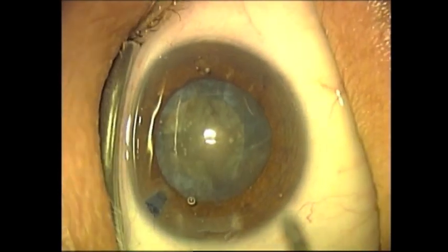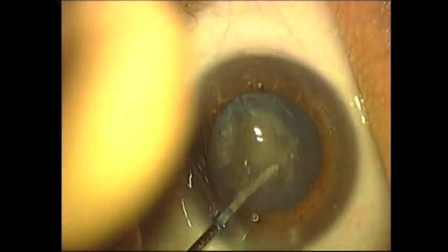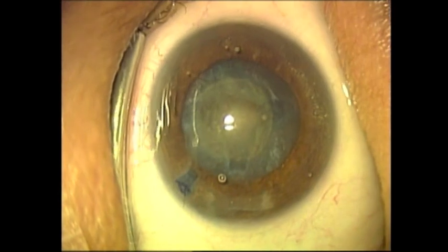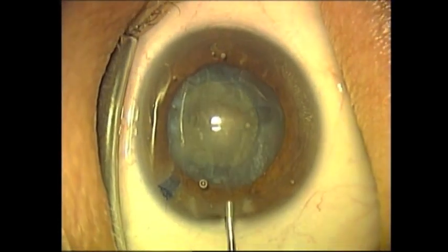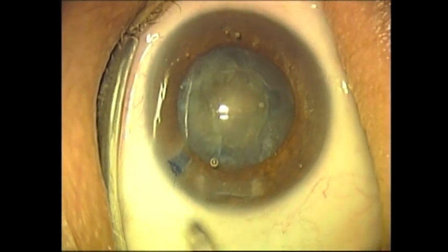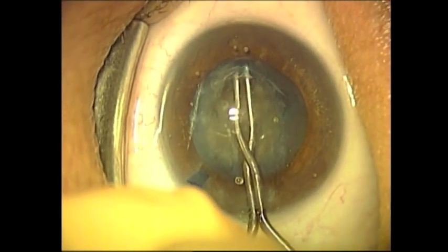The lens is then rotated one final time and the last crack is made. Having the lens fractured into four segments facilitates the removal of these quadrants by phacoemulsification. This is the second stage of the phacoemulsification technique of divide and conquer.